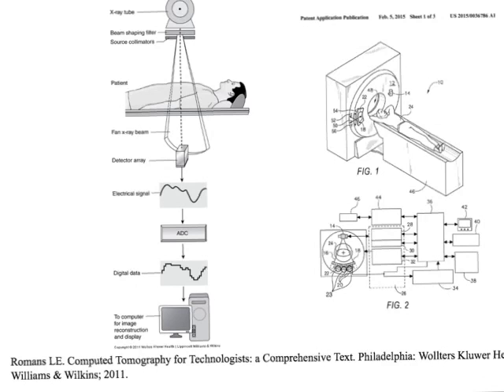So if you want to take a stab, I'll give us a few minutes to think through that here at the end of the discussion. But it may be helpful to look between the two and see what you can figure out, what you can't, and label that to the best of your ability, just to quiz yourself on your understanding of this journey, as we will, of X-ray tube to data.